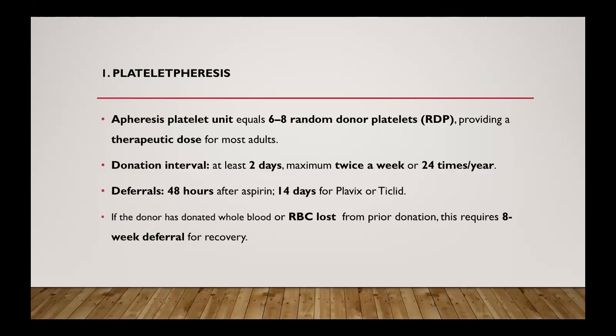Apheresis, of course, is a machine that collects blood, and that is wanted, like one unit, maybe one component, like platelet apheresis, RBC apheresis, plasma apheresis, and so on. And also leukocyte apheresis or granulocytapheresis. So now, let's talk about platelet apheresis.